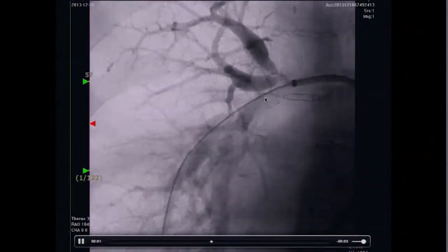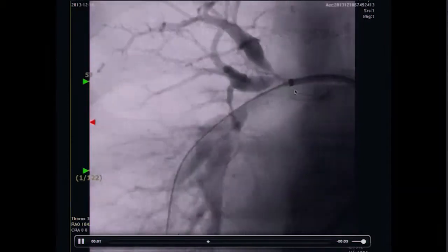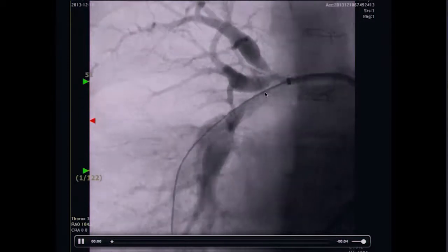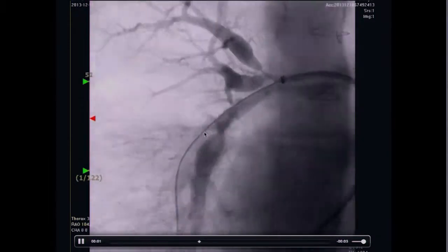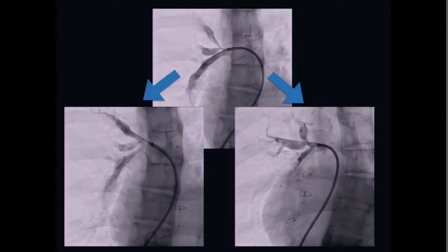This is another patient — today's live case — with the right pulmonary artery situation. As you can see, in the right upper pulmonary artery there are several segmental artery stenoses, and also in the right lower pulmonary arteries. So actually, on the lower pulmonary artery there are three portions I will intervene, and also two sides on the upper pulmonary artery. I plan to do this successfully with one angiogram.